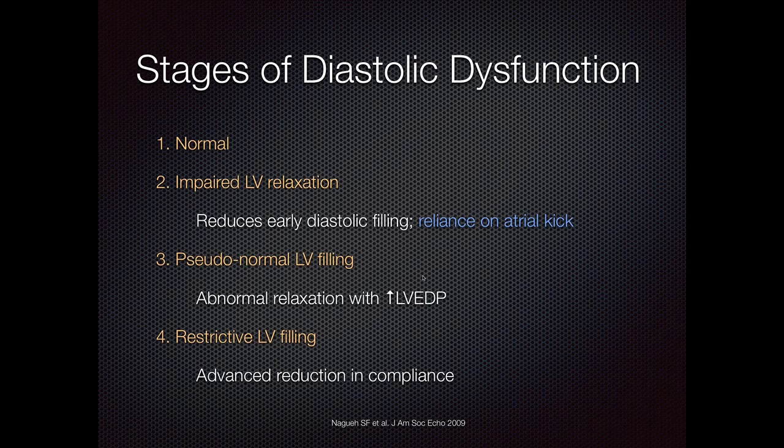Then as the ventricle end diastolic pressure starts to build up with all the filling, eventually even the atrial kick isn't contributing much. So you end up getting this pseudo-normal pattern again. And lastly, you get very advanced reduction in compliance, and you get the restrictive LV filling pattern, and that's kind of late stage diastolic dysfunction.